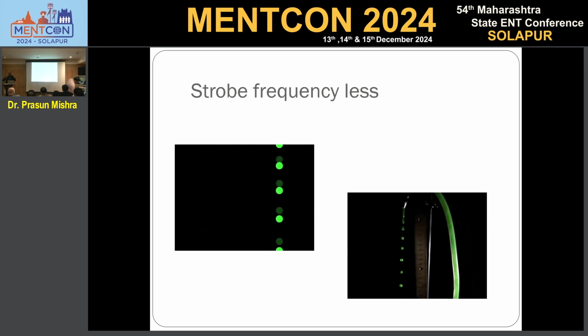If it's a fast moving fan, someone asks you how many blades it has, we won't be able to tell. It can be 2 blade, can be 3 blade, can be 4 blade. But if we are using a flickering light on it and we can see the movement of the fan, we can say whether there are 2 blades, 3 blades, 4 blades.